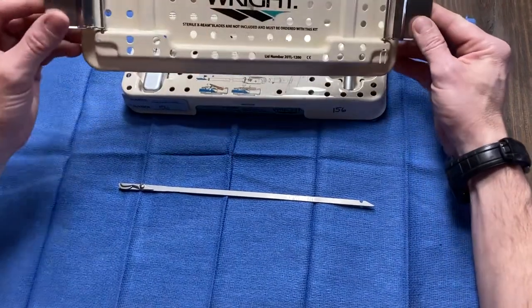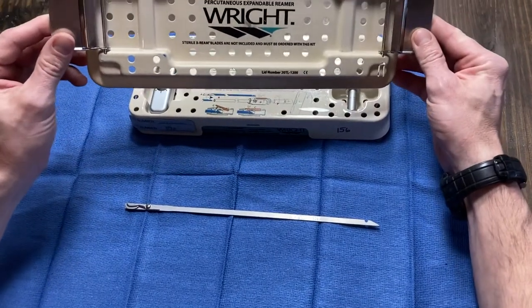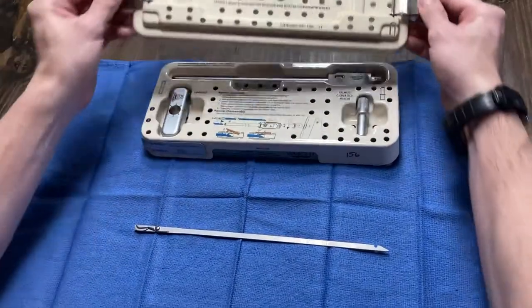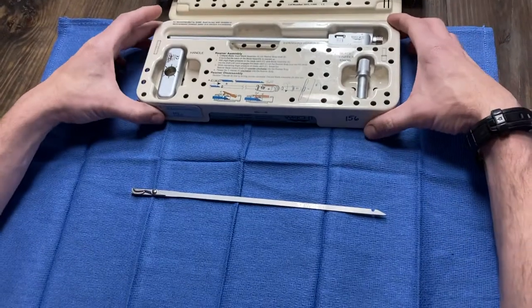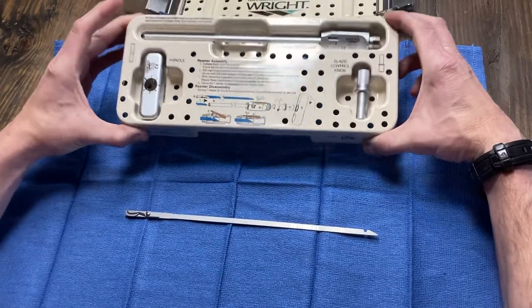This is the X-Ream T-Handle by Wright Medical. This is what you get sterile. There are no instructions for this except inside the container when you open it, and if you can't get to this because it's sterile, then you can't read the instructions. So I'm going to show you how.